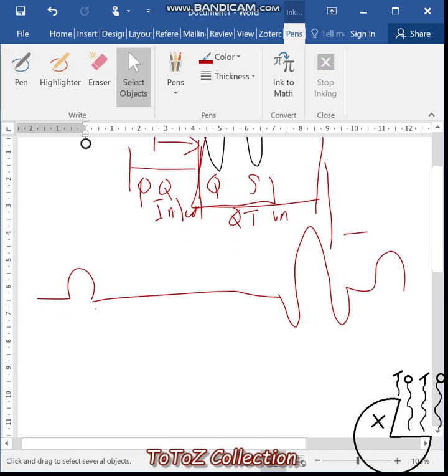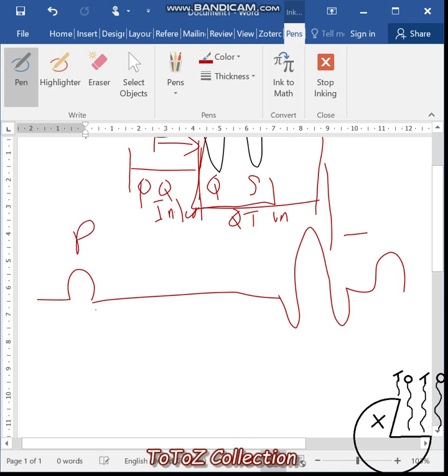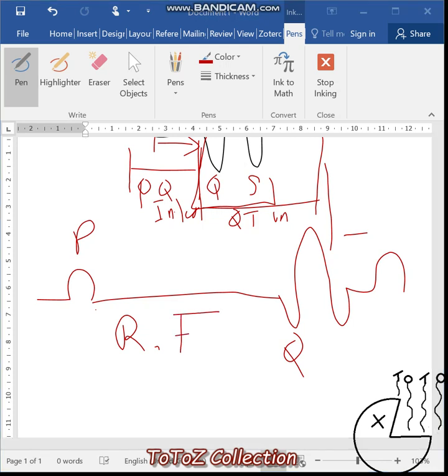Alright, so the condition that is going to prolong this PQ interval is rheumatic fever or any coronary artery disease, an infection or myocardial ischemia. But mainly we'll just say rheumatic fever. So that is our first condition.